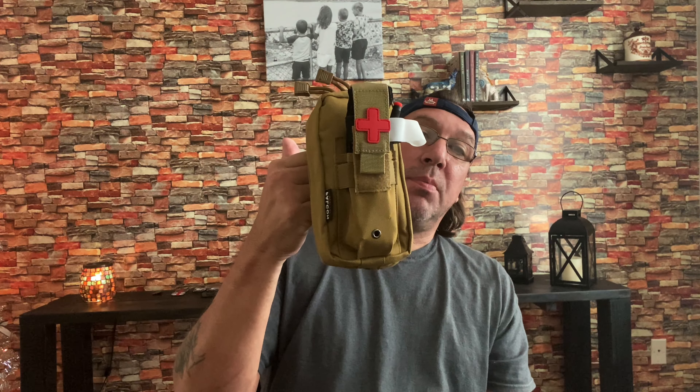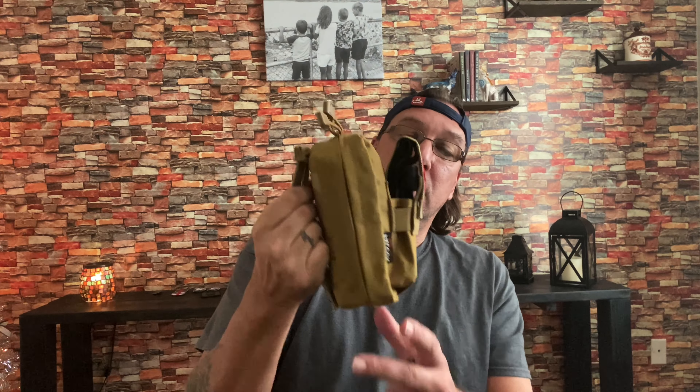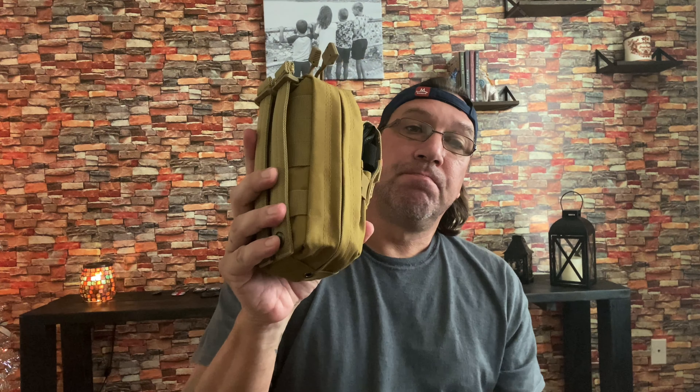Here we go, we have our trauma pack all put together and I thought I'd show you what I got in it and how I have it set up. Again, this is just my opinion. These are things that I thought would come in handy, things I thought I would need. By no means am I a medical expert saying you have to set up a pack like this. I'm just showing you what I thought would be useful and how I got it set up.